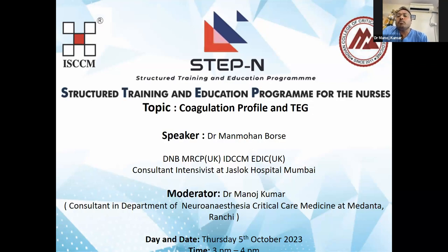One other important aspect is TEG. If you measure the coagulation profile, it measures isolated values like PT/INR, APTT, and fibrinogen levels. But TEG measures the gross total effect of how the coagulation factors interact with each other. So for that purpose, we do TEG.